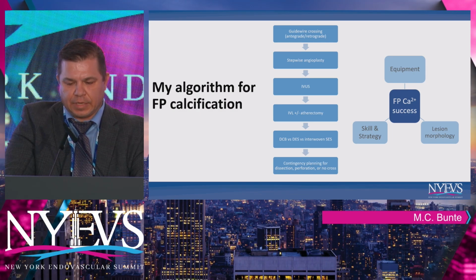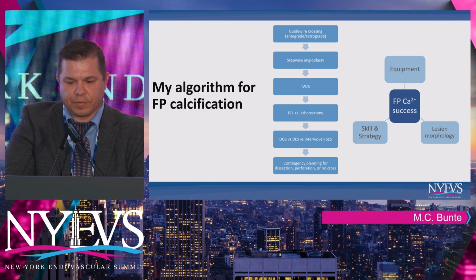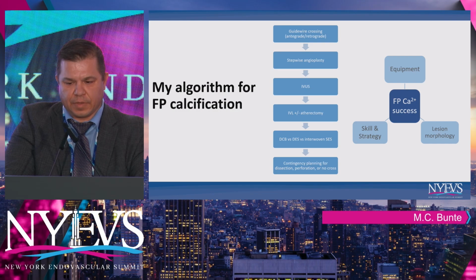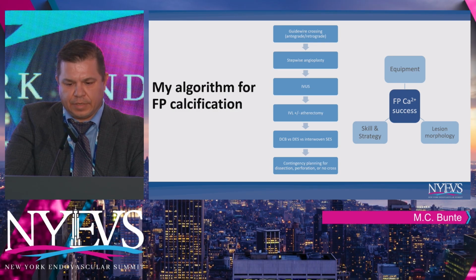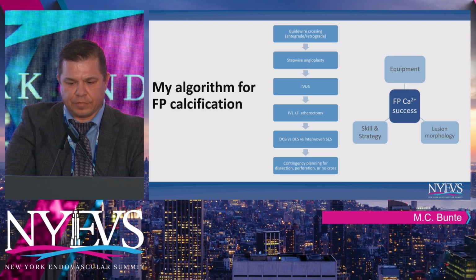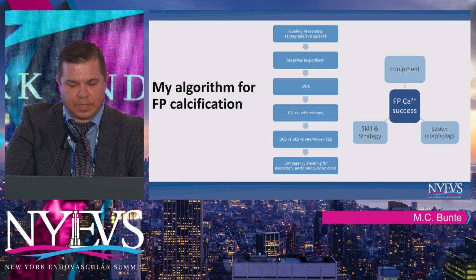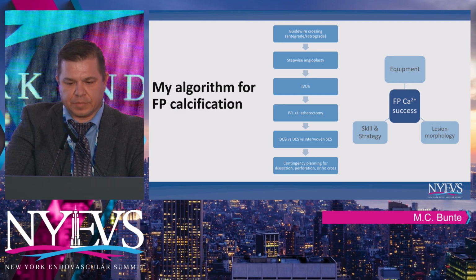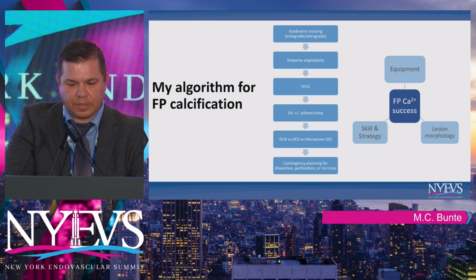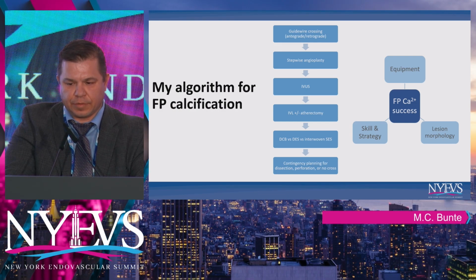I feel like it allows me to see if I'm going to pull an atherectomy device where I really need to focus my attention. It's very difficult to treat these long femoropopliteal lesions with a device without having consequences, including the consequence we saw in reality and other studies. IVL versus atherectomy depends on a lot of the lesion characteristics, which this panel has discussed, but certainly delivering drug is important. Interwoven self-expanding stent is another important strategy. And then contingency planning for dissection, perforation, or inability to cross.